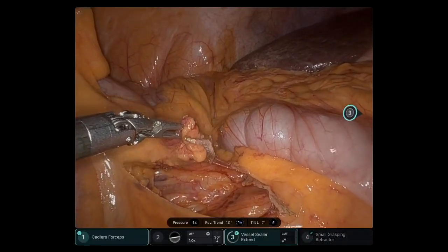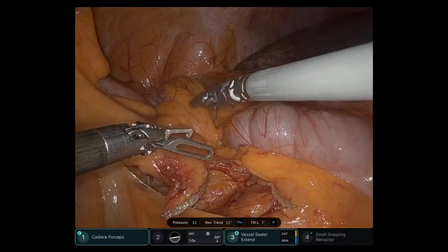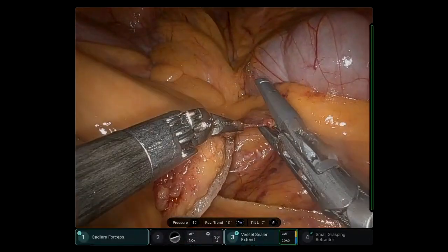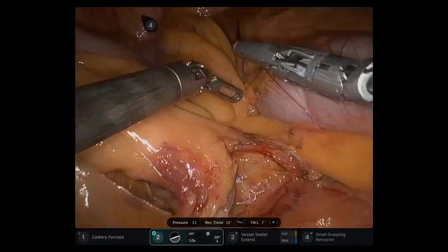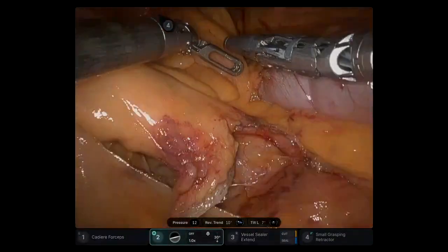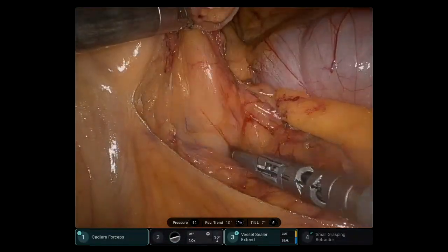I will show you more examples here. When there is a green dot, it means that when the assistant is pushing the instrument, it is not going to hit any structures. So it's a very useful tool.